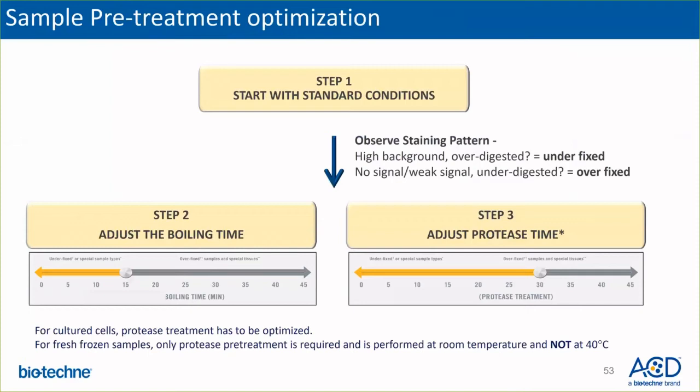If the recommendations for your sample type are not available in the user manual or a tech note, it is always best to start with standard conditions. This will help to set a baseline for how the assay performs, and based on your results, we can make recommendations to either scale the pretreatment up or down. Both the target retrieval and protease digestion perform on a single sliding scale, such that you may adjust it depending on what your samples look like or the fixation conditions of your samples.